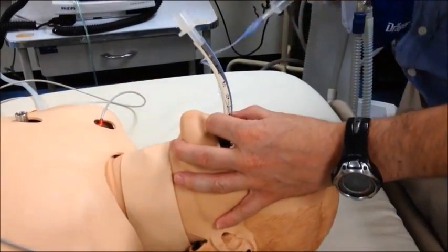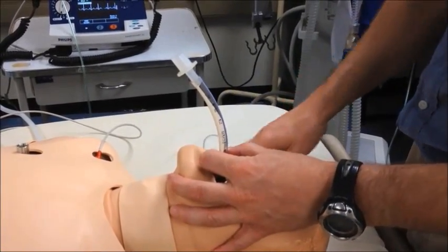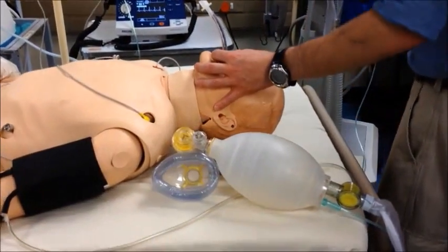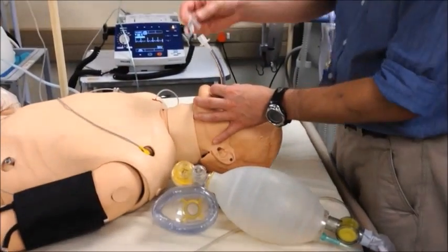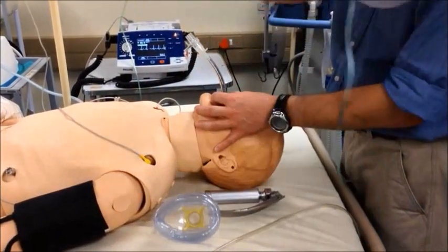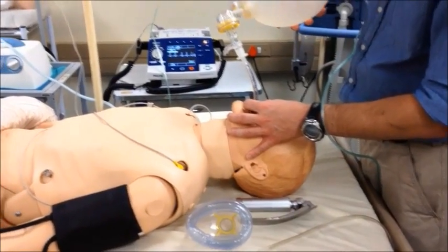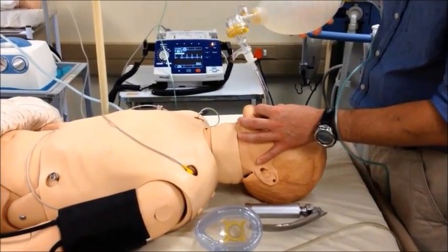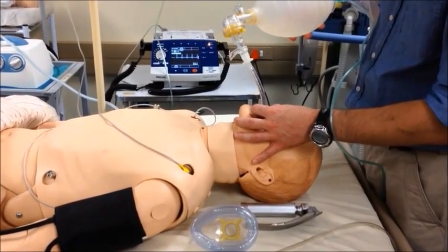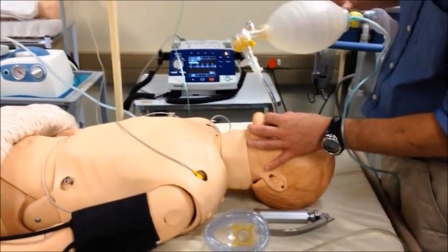Maintain control of the tube and inflate the cuff. You would now attach your secondary detection device — in this case a CO2 colorimetric detector — and then your ventilator device to the tube. You would then confirm position of the tube. Classic five-point auscultation can be performed by an assistant, or an assistant can take over control of the airway while you do the auscultation itself.